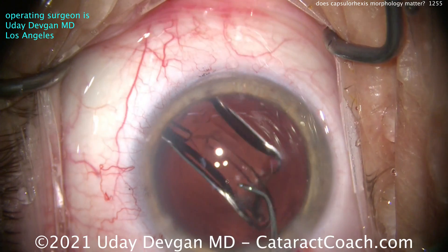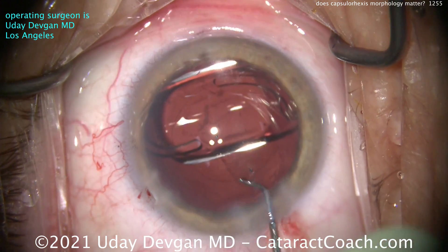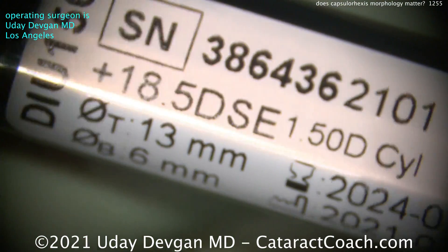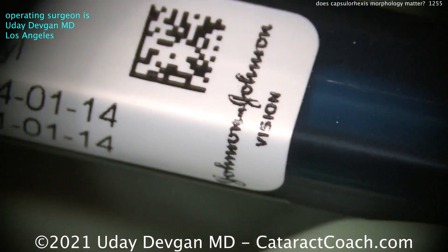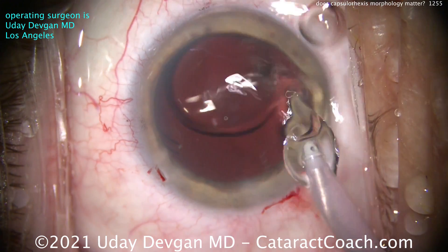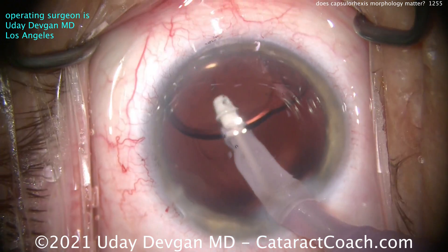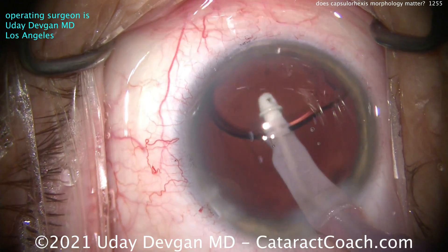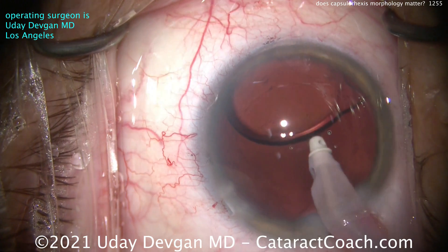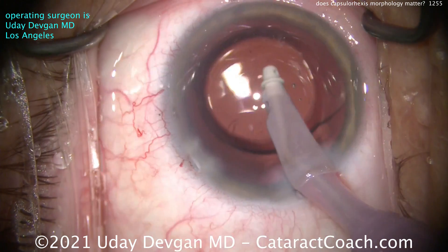If you had a basketball player who threw 90% from the free throw line, you'd say that's pretty good. If you saw one who threw 95%, you'd say that's excellent. But as a surgeon, your patients won't allow you to shoot 95% in terms of accuracy. There's the lens — the Tecnus Toric Eyehance Monofocal — already in the eye. It looks great. You can see at the end it's a beautiful overlap. If you have at least seven or eight clock hours of overlap, you're probably going to keep the lens in its normal planar configuration.